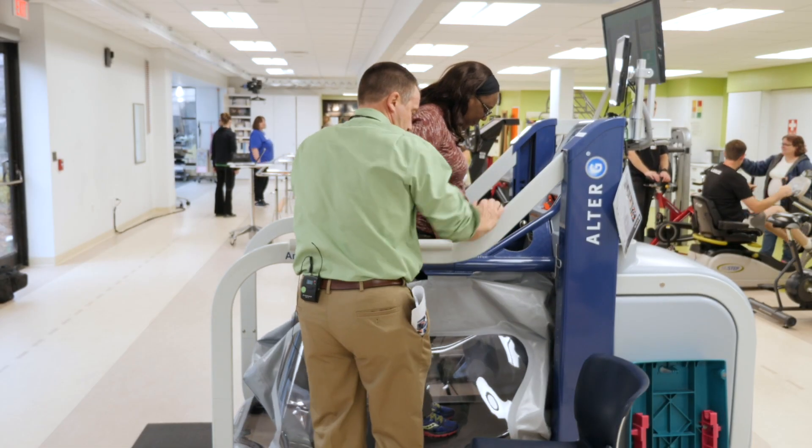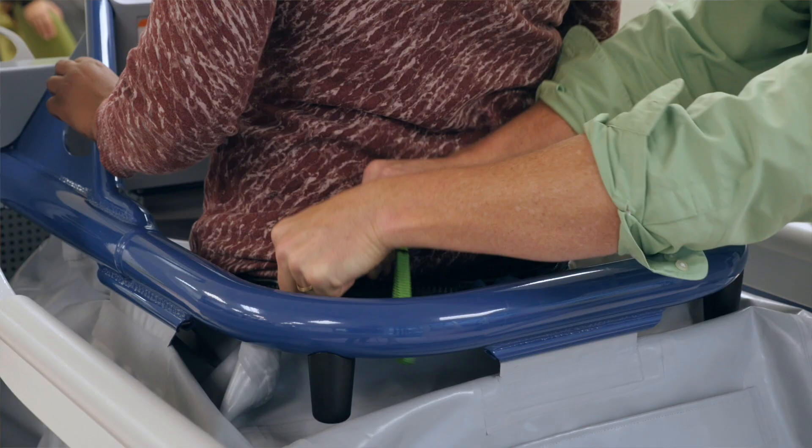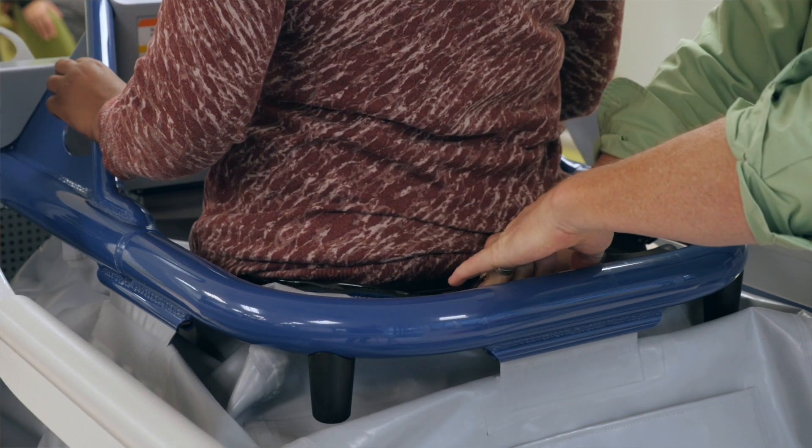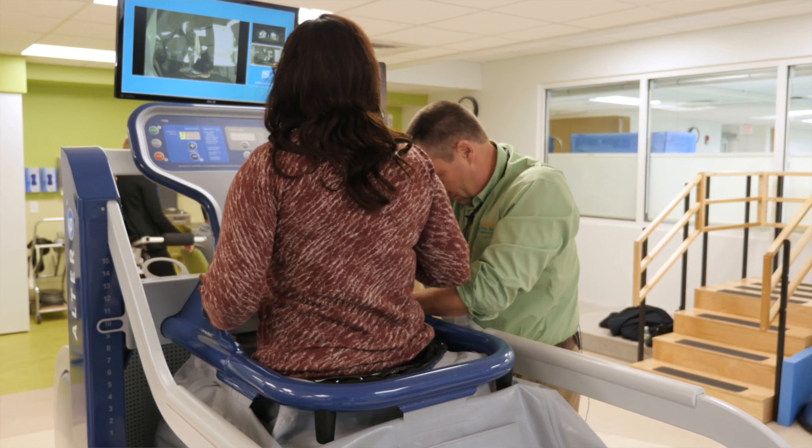Ultra G works on differential air pressure, and that will de-weight the individual up to 80% of their body weight — so they'll be walking with 20% of their body weight on their lower extremities.